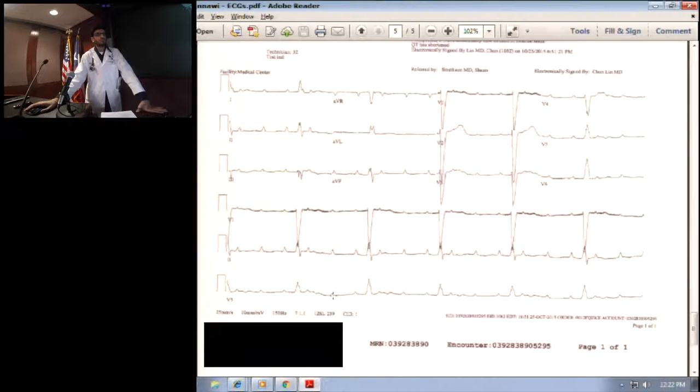From the prevention standpoint, I think the lesson is that if you are going to do a right heart cath in a patient with a left bundle branch block, we alert that around 5% of those patients may get a right bundle branch block, and if your patient already has a left bundle, they can have an AV block. We have a transcutaneous pacer in our cath lab, but we can also be prepared with a pacemaker wire and the pacemaker box in the room. We already have access, so it's really fast. If you're asking about prevention, I would have a pacemaker wire and generator in the room in case you need it.